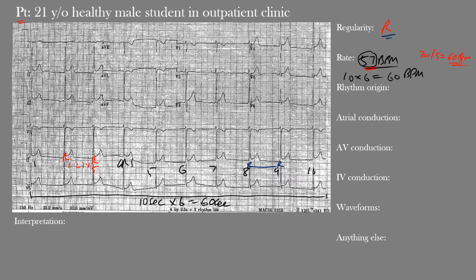Remember, when we look at sinus rhythm, if you imagine your heart, let's first draw the heart here. This is our right atrium, left atrium, right ventricle, and left ventricle. And then you have our conduction system. Here's our sinus node, starts up there, and it comes down these internodal pathways to our AV node, splits off into the right side, the right bundle branch. We have our His bundle here too, and then our left bundle branch that splits into a left anterior and posterior fascicle. You also have a Bachmann bundle that comes over to this left side.